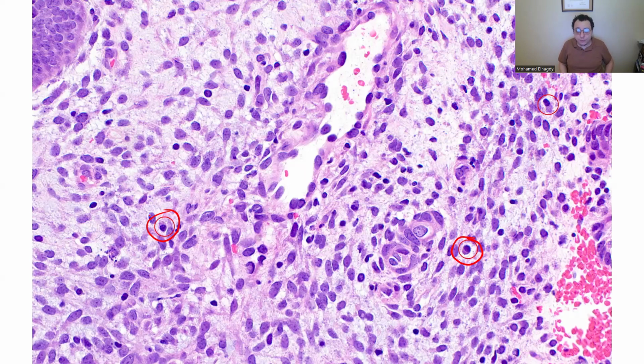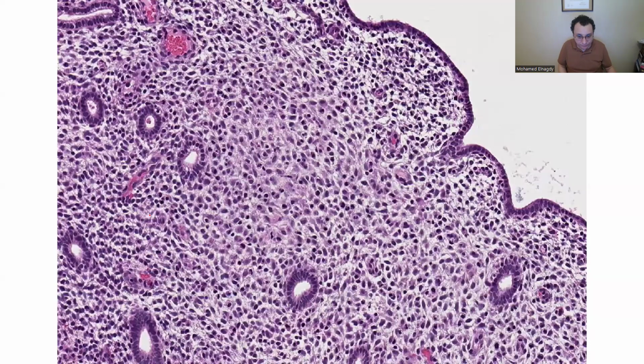Sometimes you get a lot of endometrial biopsies, I understand. So you might say, let's look at this because most of them are benign, we will focus on the malignant. But when you open the history and look if the patient has an IUD in place, it's either a copper IUD, so you'll be looking for chronic endometritis, or it's a Mirena or progestin IUD, so you will start looking for decidualization. So this history helps a lot. That's why I'm saying how bland it might look.